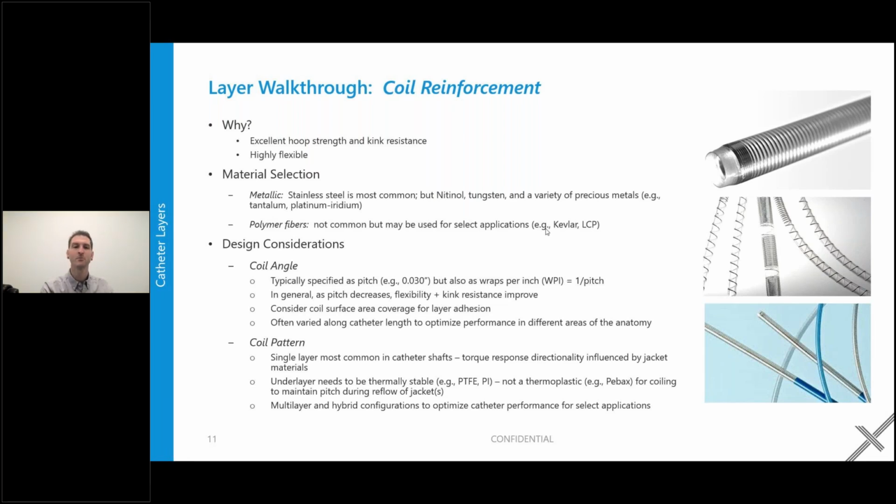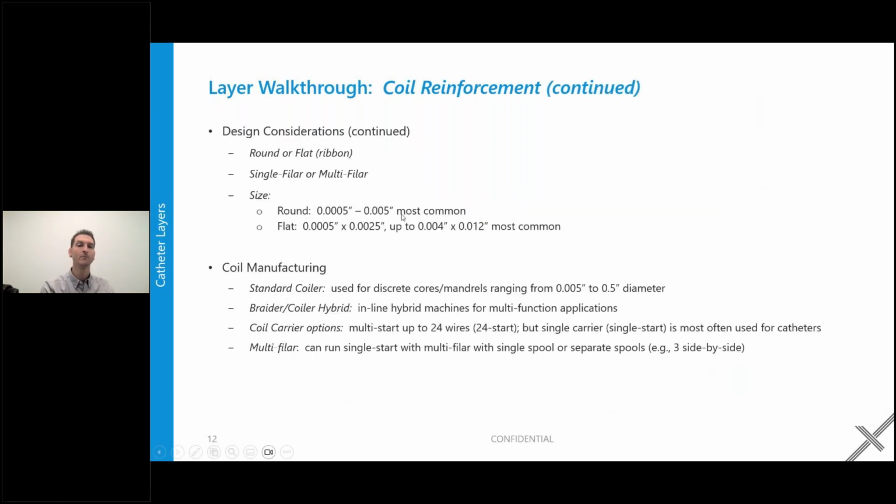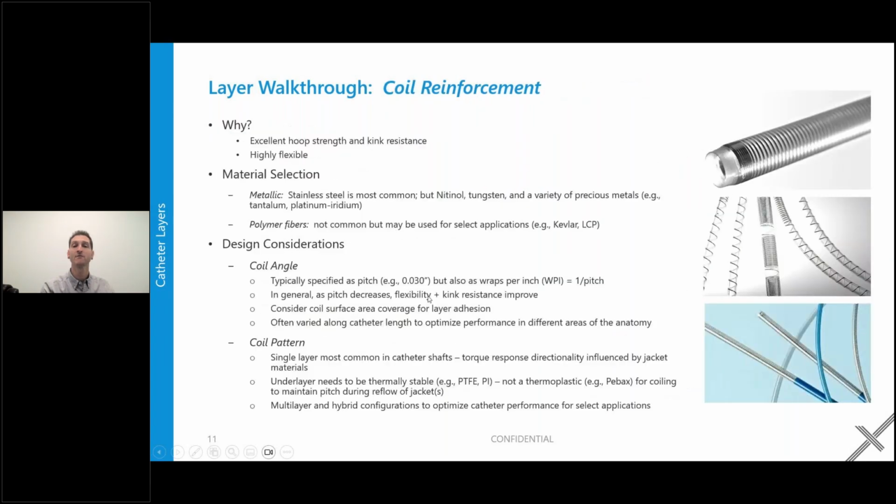Same ones that you would have used for the braid. They're not going to give you the kind of performance in hoop that you're going to get from a metallic element.